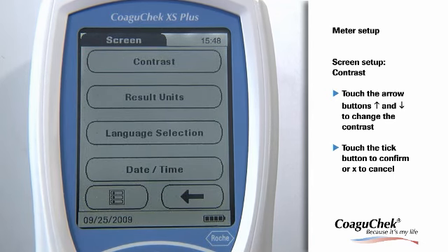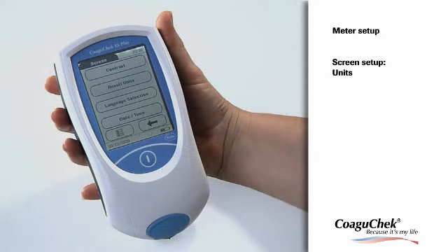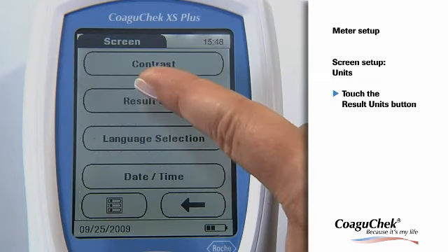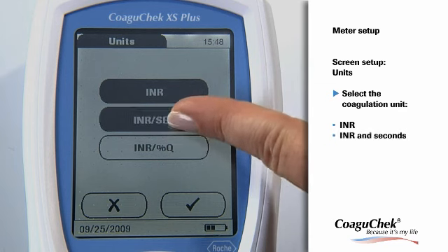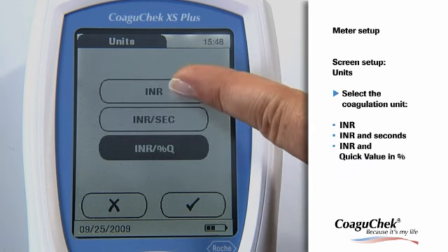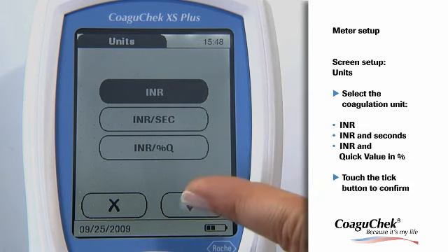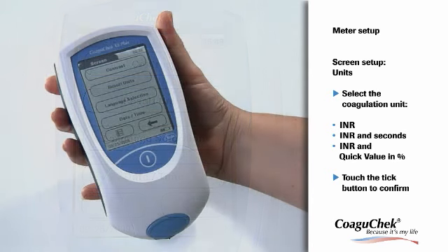The program automatically returns to the Screen menu. The next Setup option enables you to set the desired unit. Touch the Units button and choose the Coagulation unit. You can select INR, INR and Seconds, or INR and Quick Value in Percent. With the Tick button, you can confirm your setting. The program automatically returns to the Screen menu.